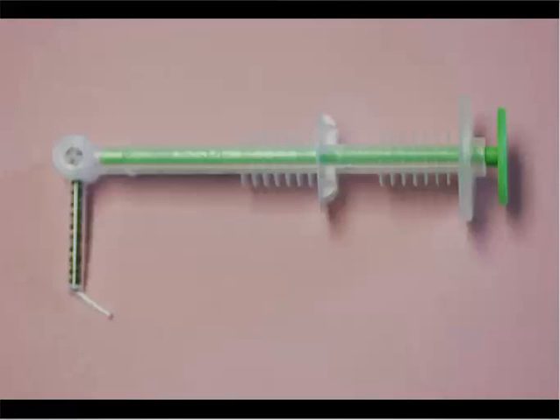This is a disposable syringe from 3M, which has really offered us a lot of advantages. I showed you the other one that we used before with the aluminum tip. This can be cocked to a 45-degree angle. This plunger is pulled out in these portals. You take your Automix cartridge and snub that up against there.